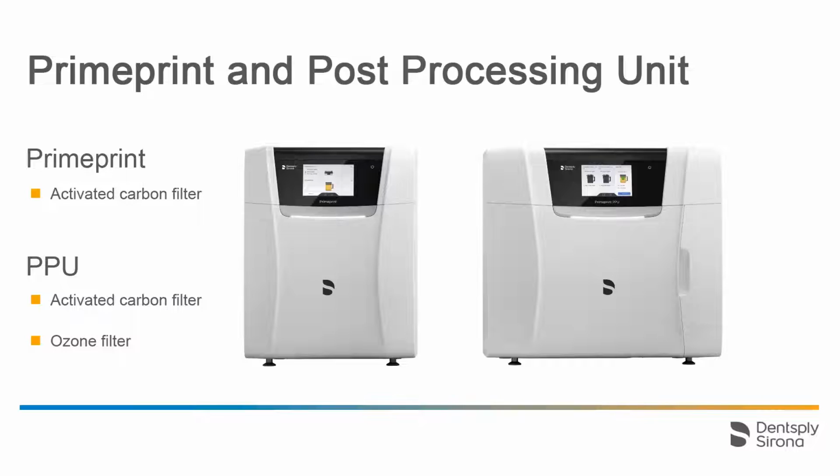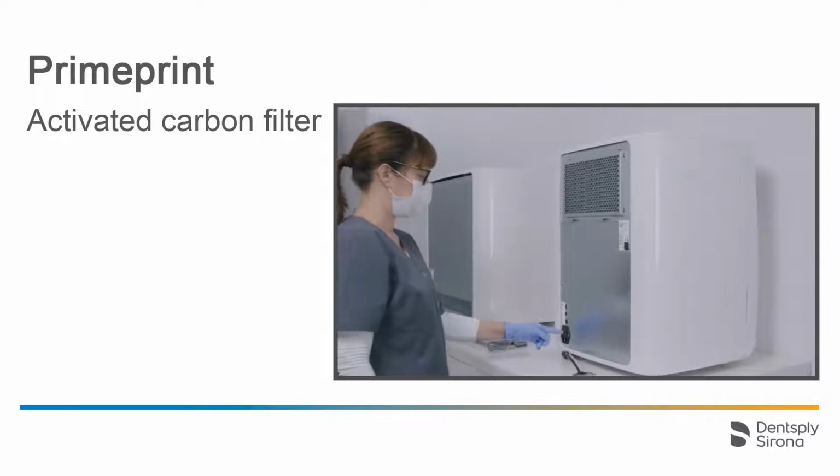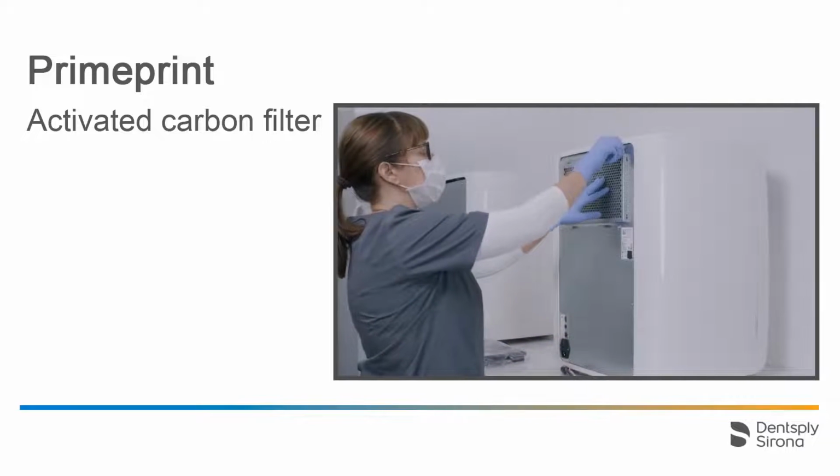While performing the above-mentioned activity, a mask, appropriate gloves, and eye protection must be worn. We will then start with replacing the activated carbon filter in the Primeprint. The Primeprint activated carbon filter is located on the rear of the device. The Primeprint should be turned off during the exchange.